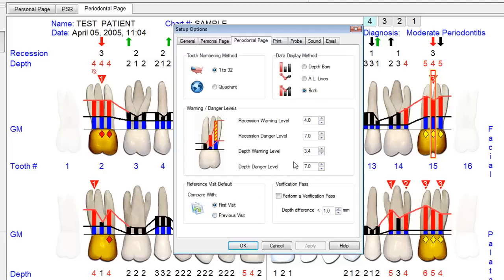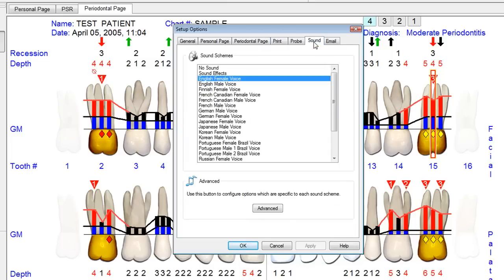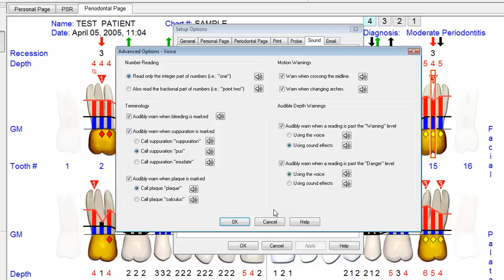Our warning levels are where we set both the warning and danger levels for both the on-screen and sound files. The sound features allow us to flip between a multitude of different languages, both male and female. Here in Florida, where the product was invented, we use Spanish quite a bit — both male and female. In the Advanced Options, you have the ability to flip between specific sounds.